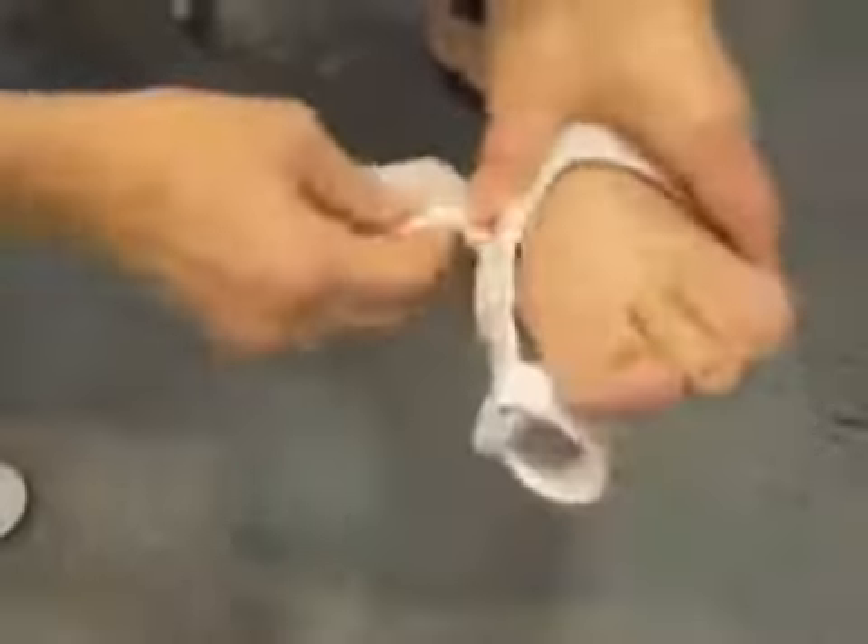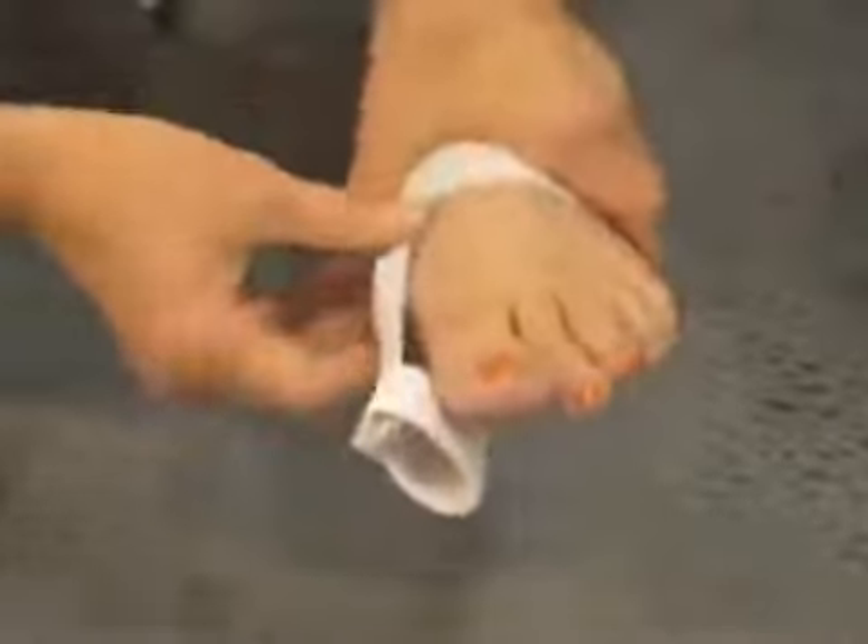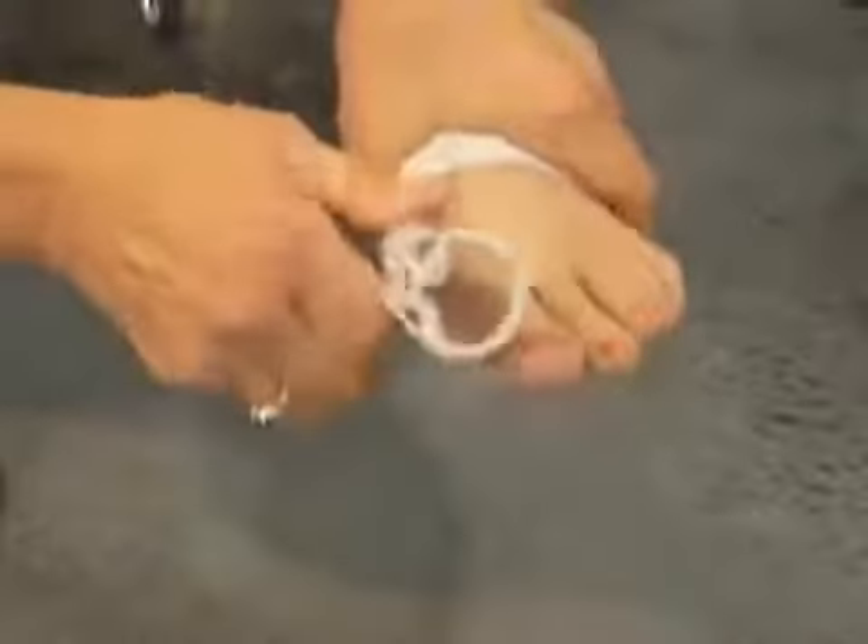The way it's applied is to first put it over the metatarsal arch, and with both ends of the strap, cinch it with equal tension around the metatarsal arch to prevent slippage and to provide support to the metatarsal arch. Then you place the hinge where the bunion is located to protect it.